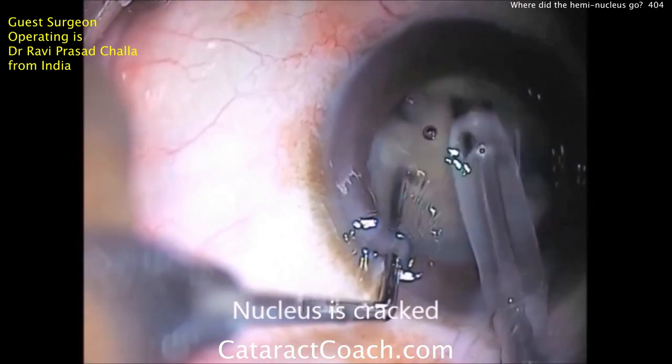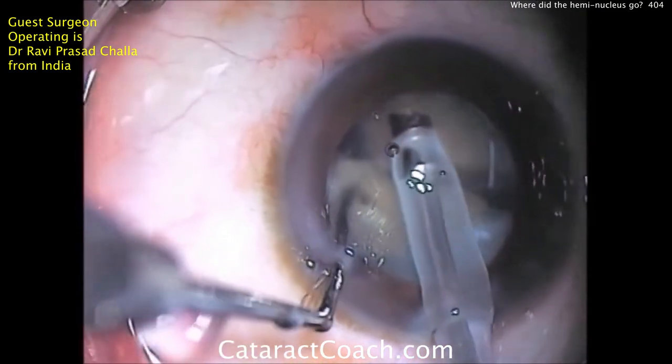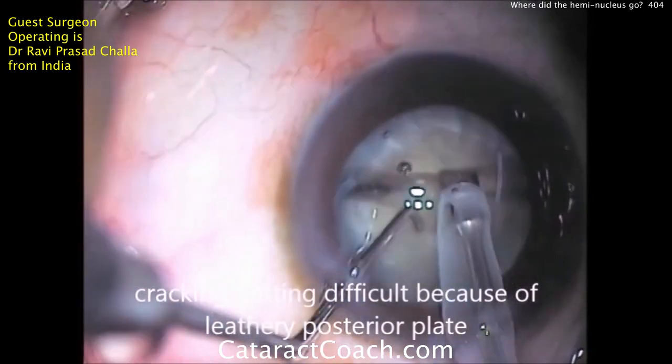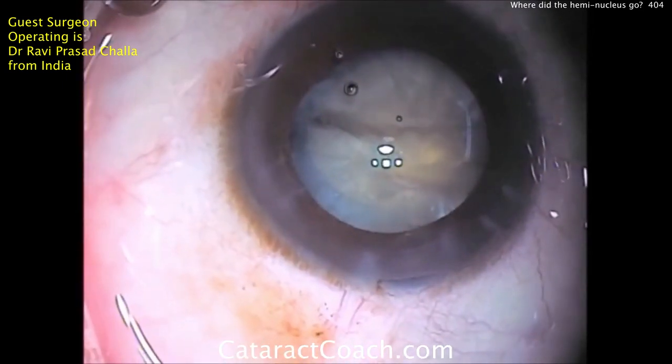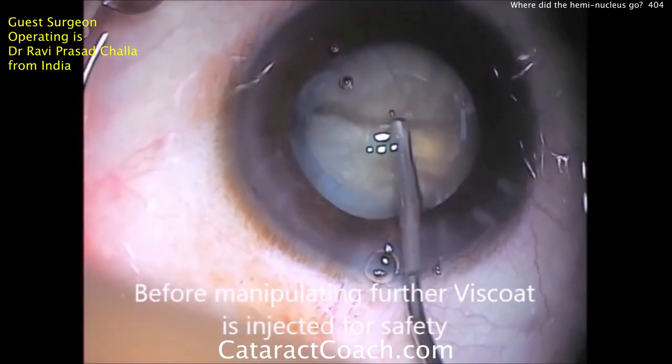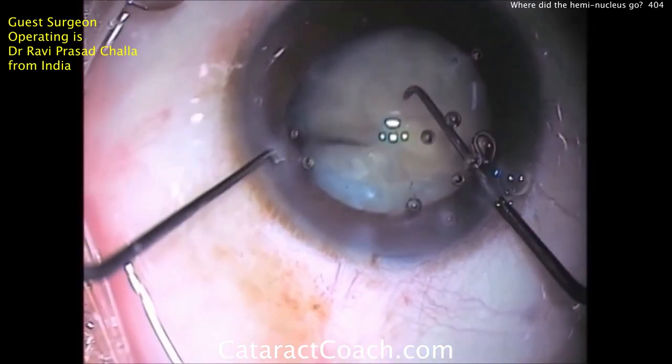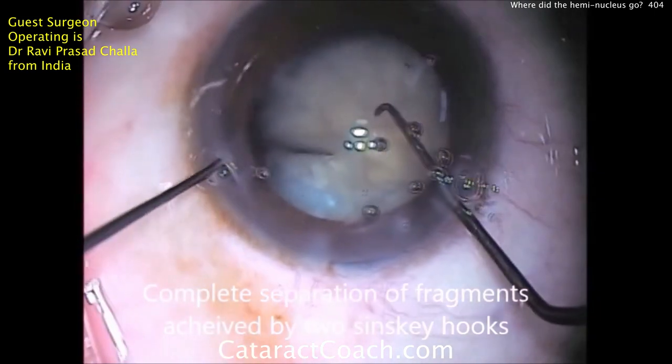As a result of having a thick fibrous posterior plate, you don't get a good separation here. You can see the nucleus is split but not centrally. So now more viscoelastic is going inside the eye and he's going to use a couple of Sinski hooks to do some manipulation and try to separate the nucleus.